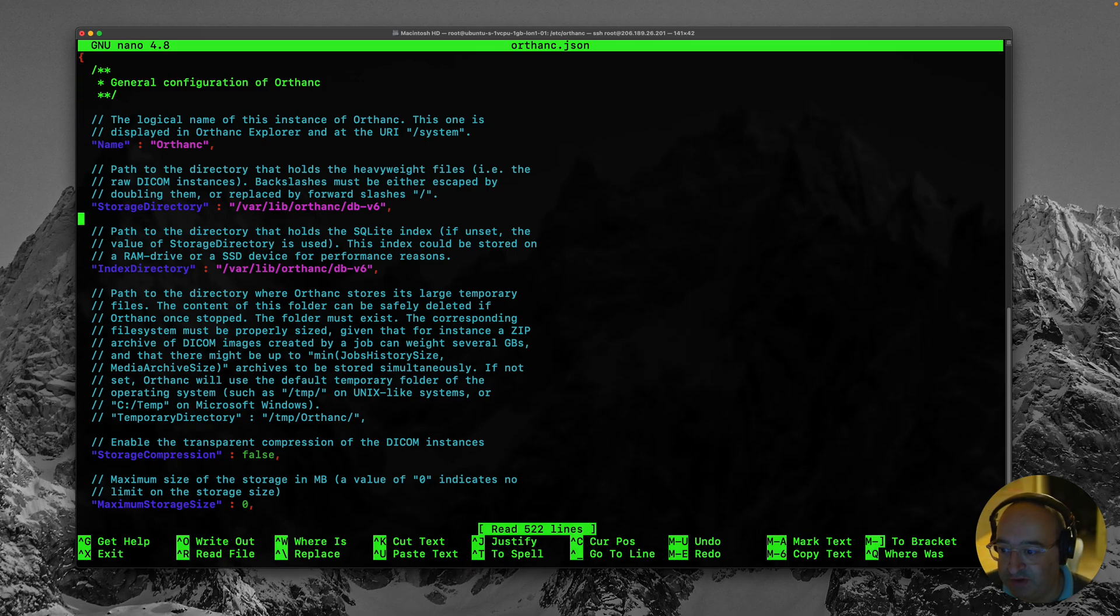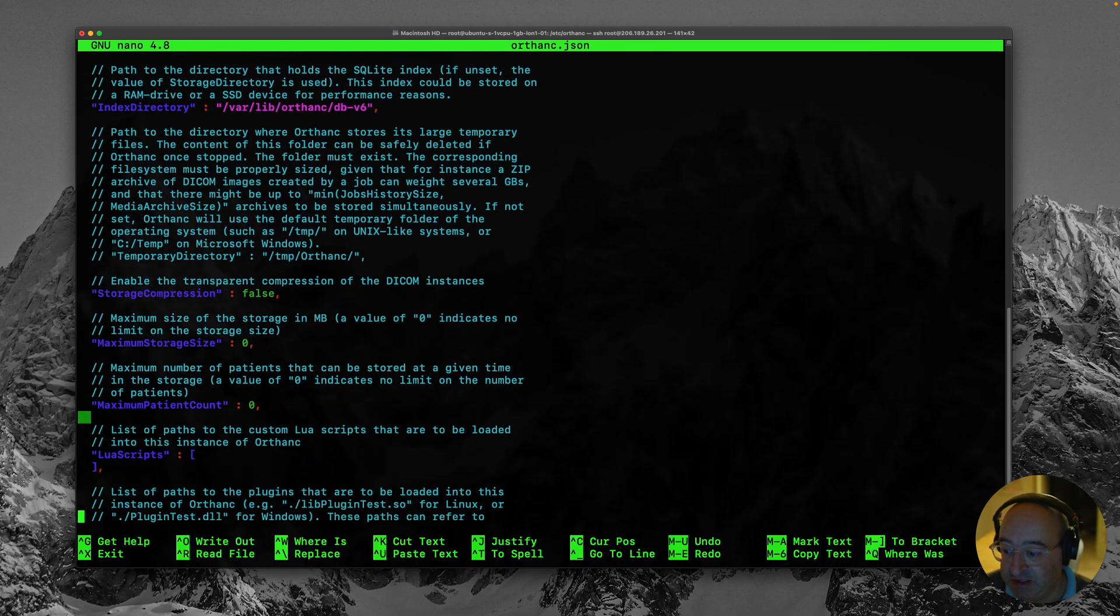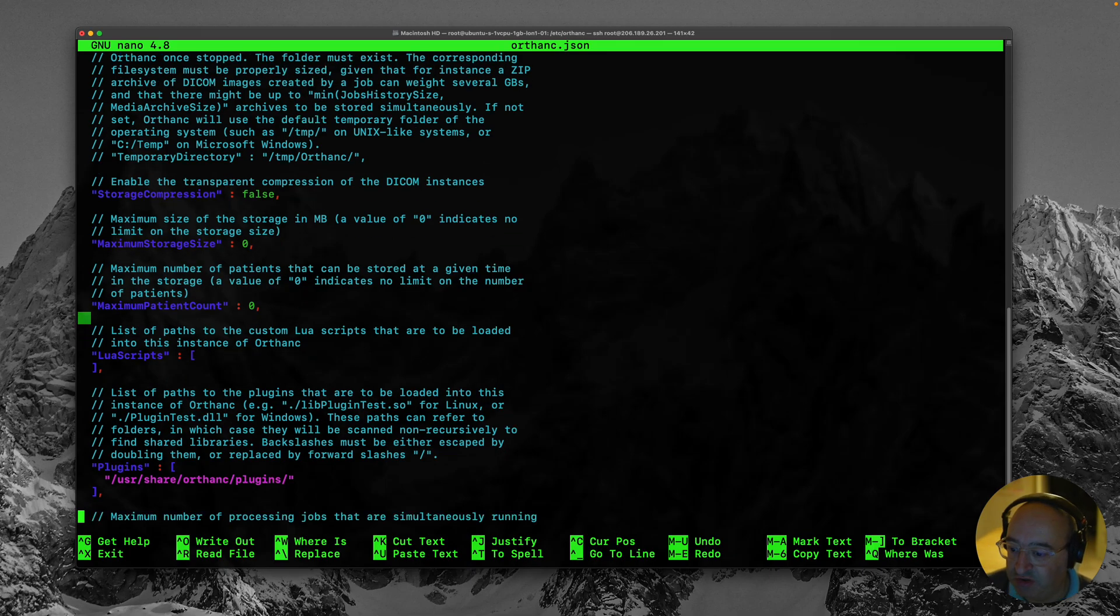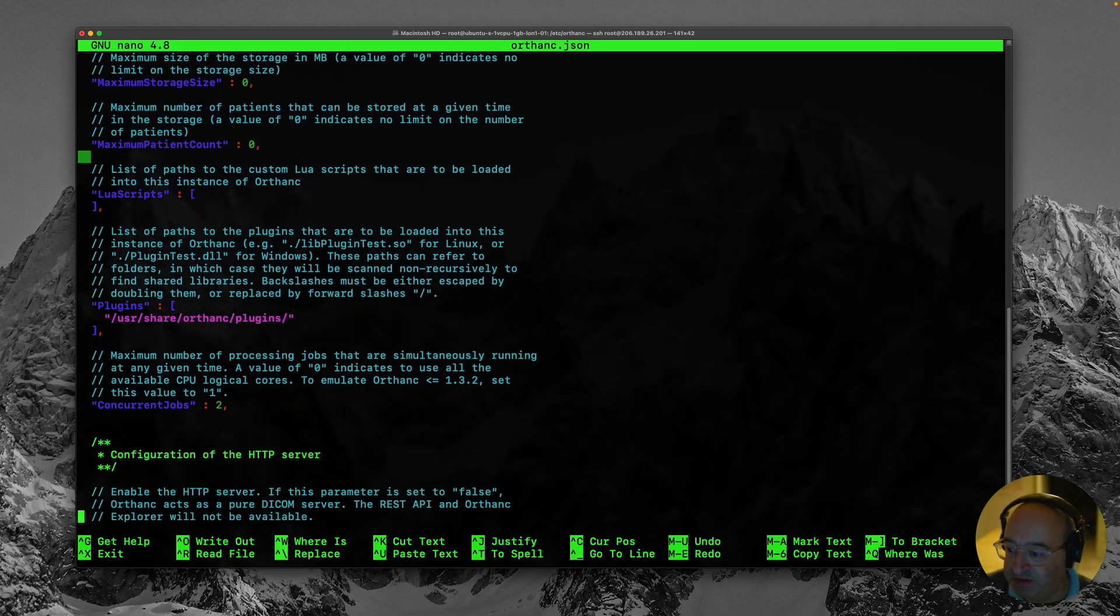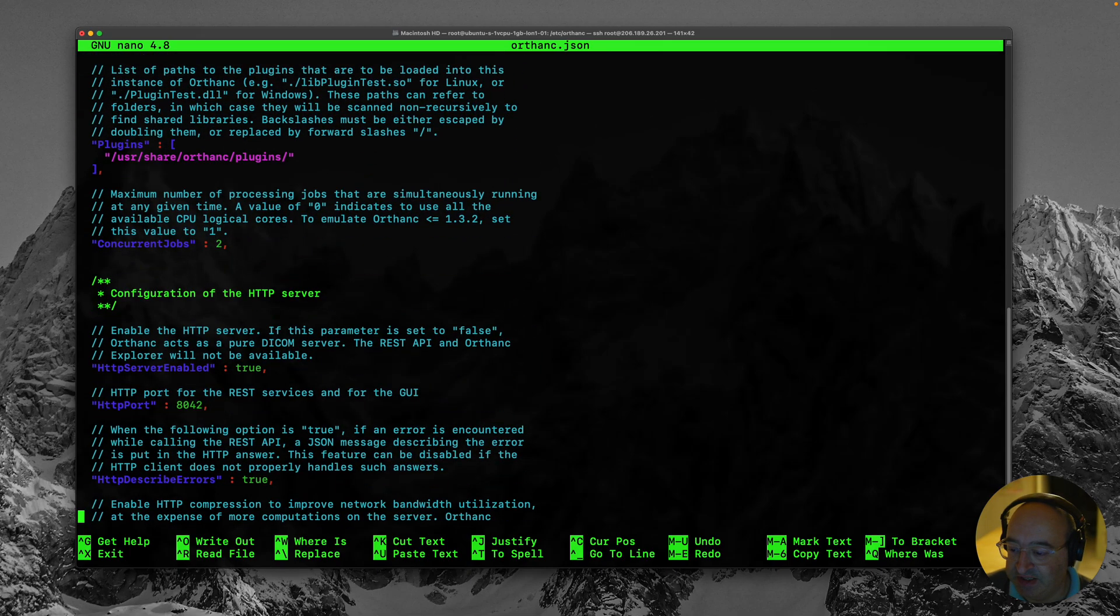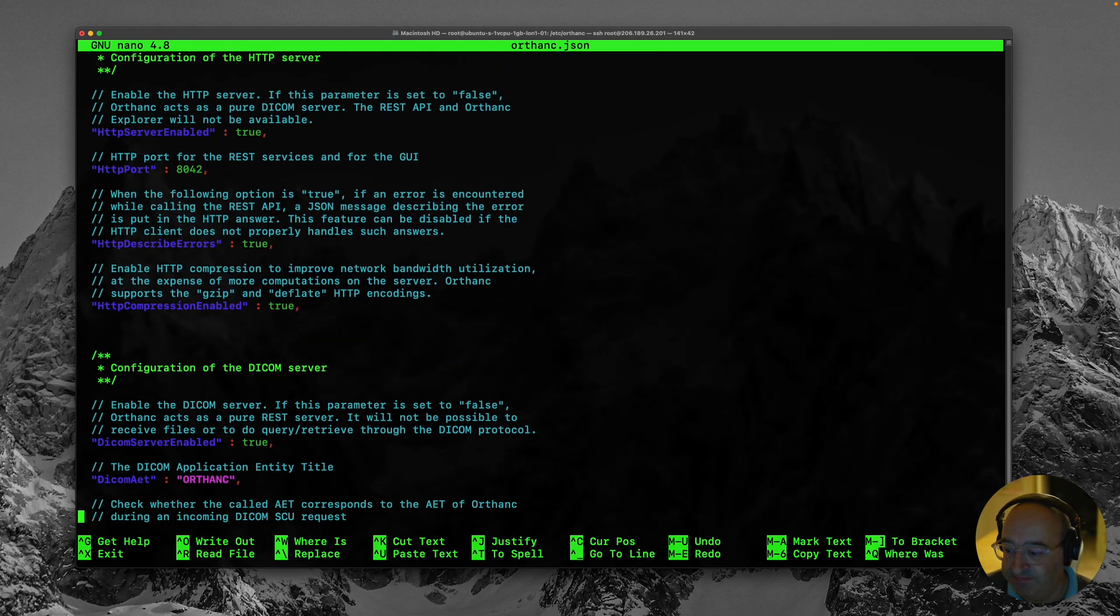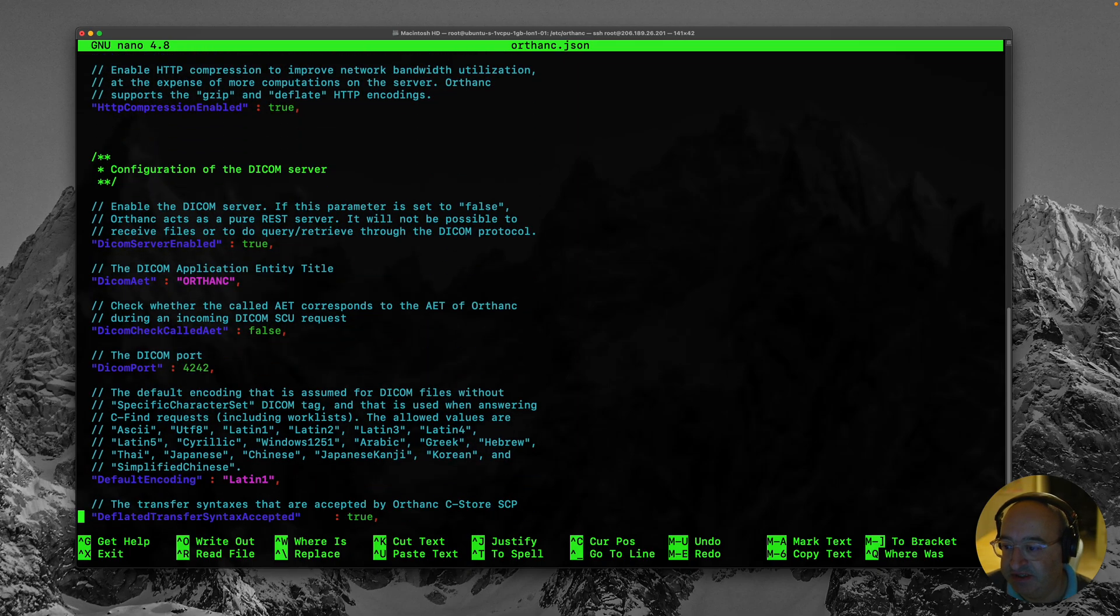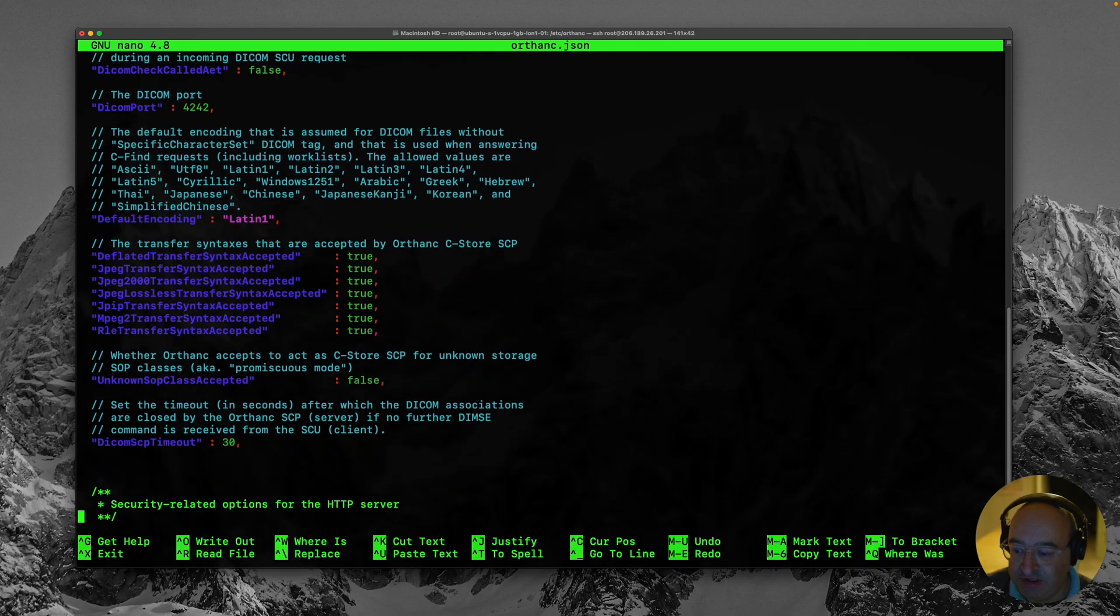So here is the configuration file for Orthanc. So we can go through and see that there are a ton of options that we might make use of in some future tutorial videos. But most of all let's just go through and try and find that section where we can gain access. So I'm going to keep scrolling down until I find something to do with users.